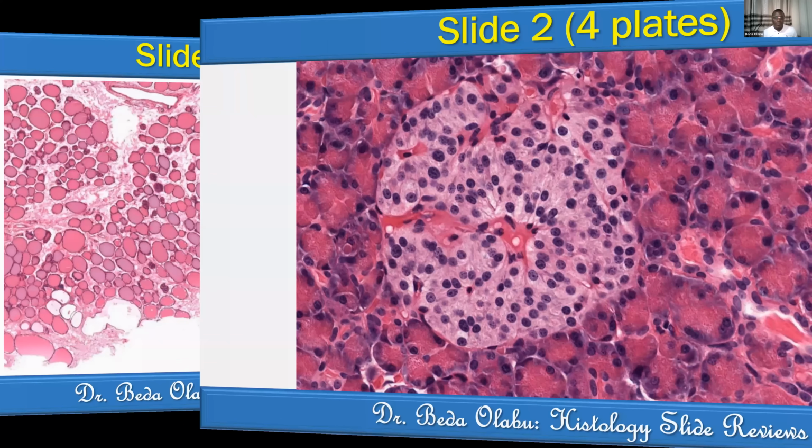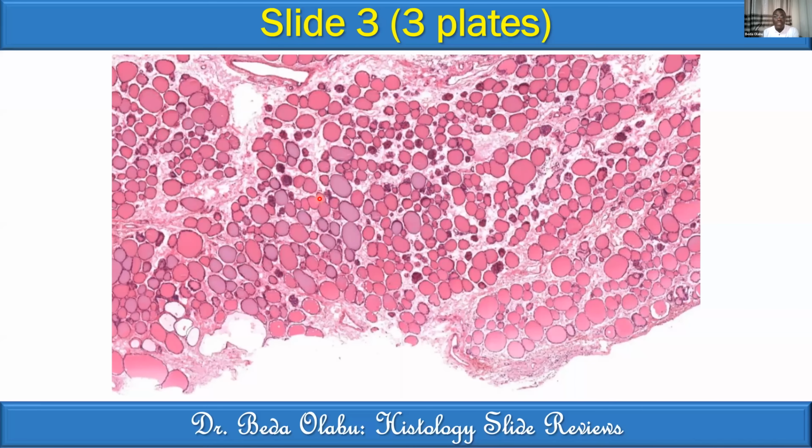Slide number 3. 3 magnifications. The first magnification is that one. Take your 30 seconds, look at it. Write something down which stands out. Okay, now that you've captured how we are doing it, I will want us to increase our speed so that we finish in time.